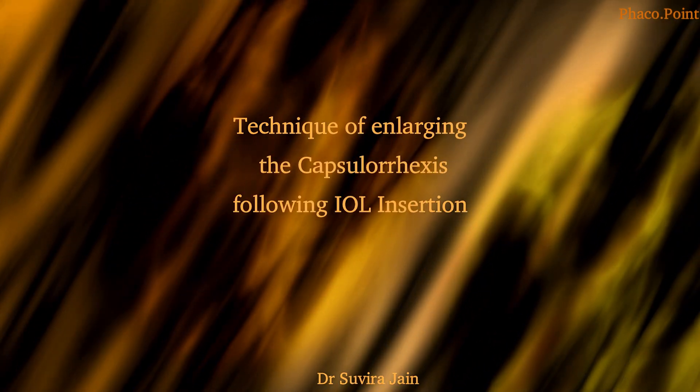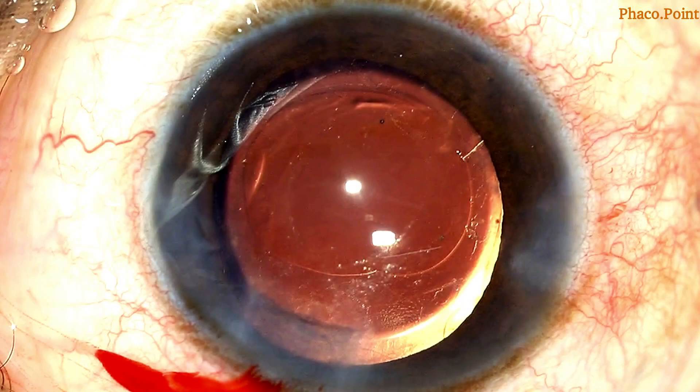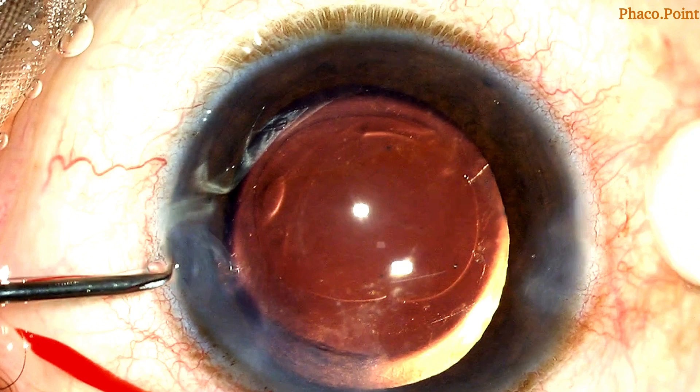Here's a simple technique of enlarging an undersized RHEXIS following IOL implantation. In this case, you can see that the superior part of the RHEXIS is undersized. Let's now see how we use a cystotome to enlarge this opening.